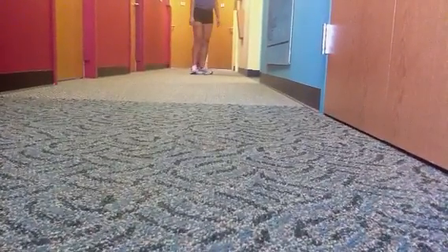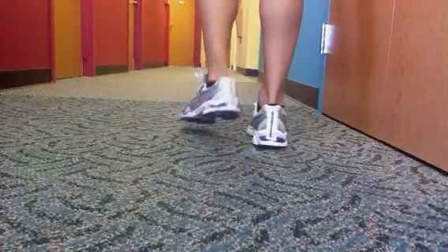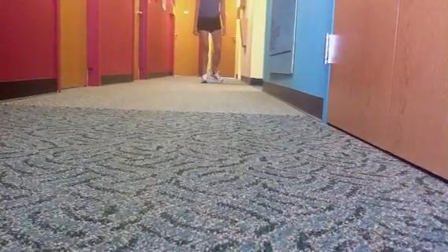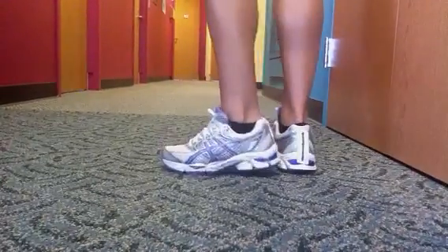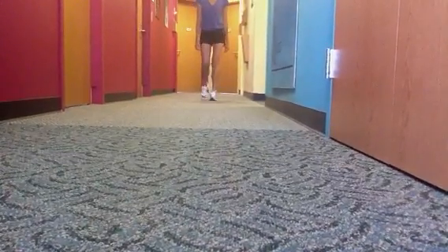When you land on the ground, your foot should pronate and then resupinate later on in the gait cycle. You can see now with the orthotics that as soon as Tiffany lands on the ground, there is no lateral instability, which is called excessive supination. This is also called, in the literature, underpronation.